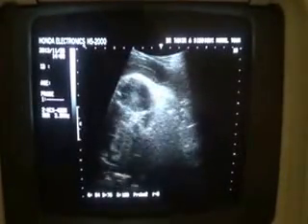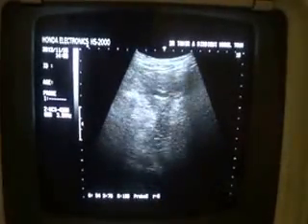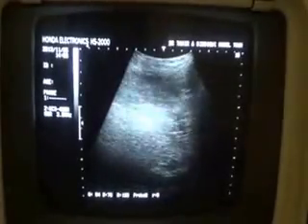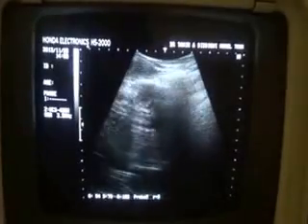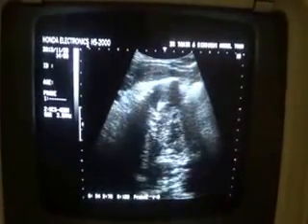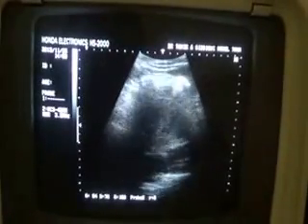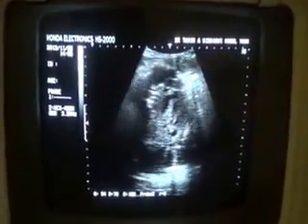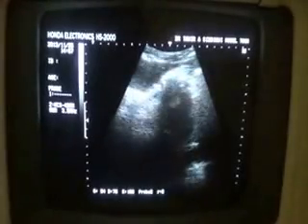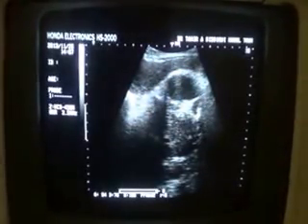She has no difficulty in micturition. As you see, the urinary bladder is collapsed. I saw this patient with a full bladder with nothing significant, and it was difficult to get the total dimension of the mass, so I asked her to empty the urinary bladder, and then I was able to see this complex mass in total along with the uterus. Here we are. So this is a case study of a complex pelvic mass in a 24-year-old female.